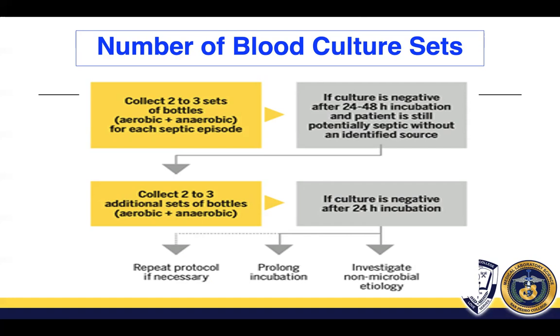And then try to prolong incubation time. Sometimes there are organisms that would be present after 21 days of incubation. So that could be it. If not, call and inform the physician and ask if you could repeat the process a third time around. So it's the doctor's call after your second trial.